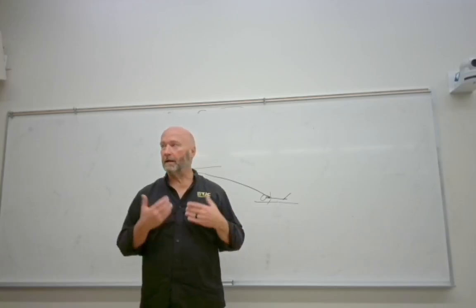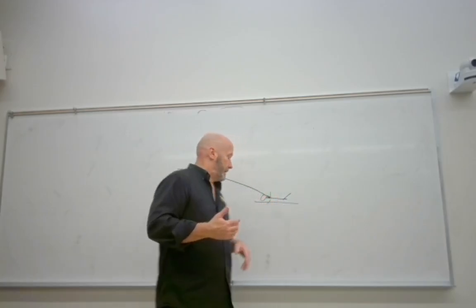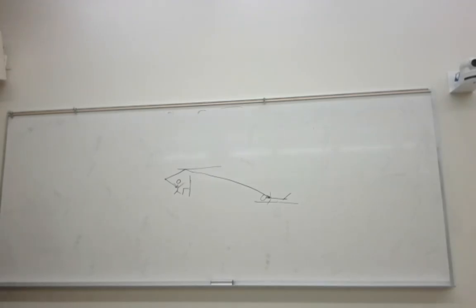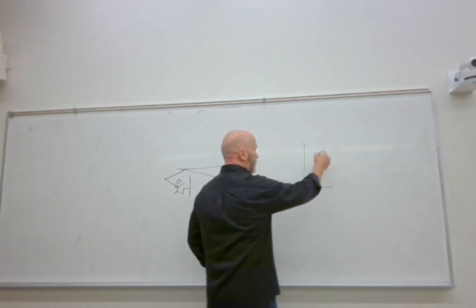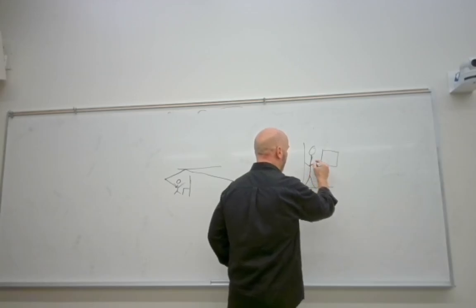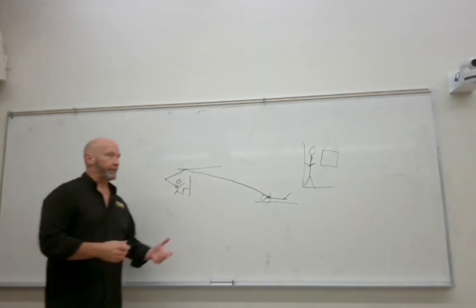You're doing an upper GI barium swallow, you might want to start with the patient standing up. All right, so the table will go 90 degrees in one direction, so the patient's standing up, right? So the fluoro tower is here, the patient is here, they're standing on that foot piece.